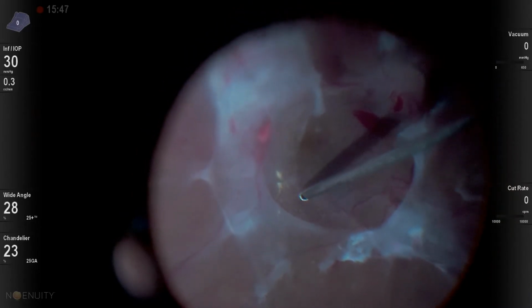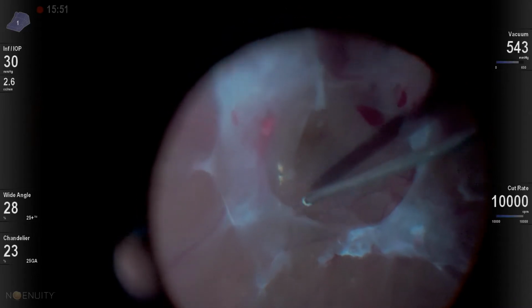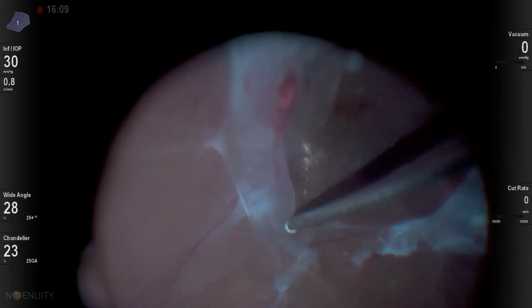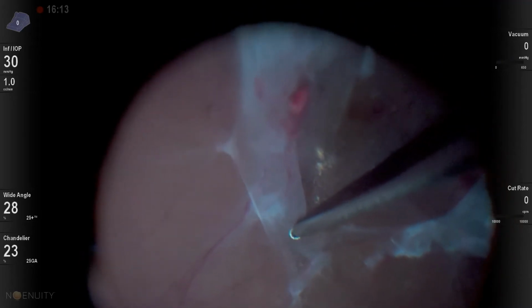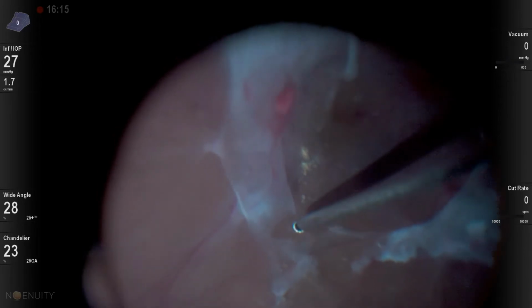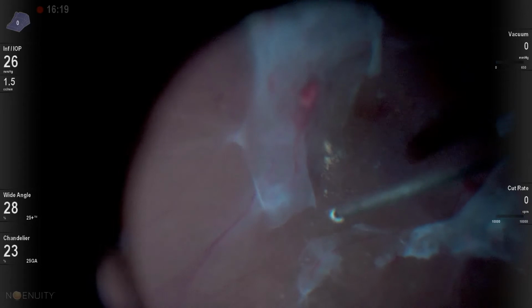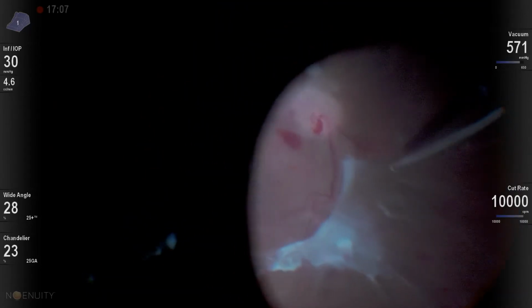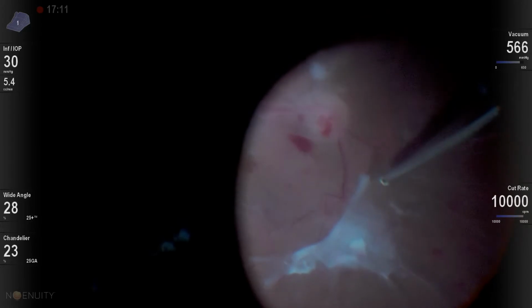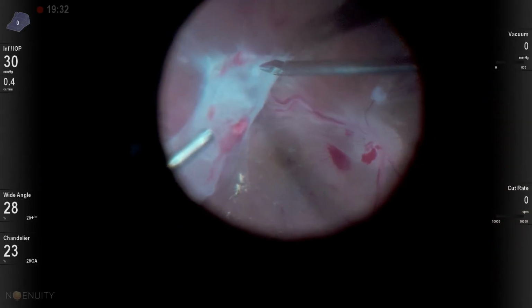And then I use this 25 gauge bevel cutter, 10,000 cuts per minute, to actually do a really nice segmentation across here. And I'm just looking for the easiest way to separate these fibrotic islands to create smaller islands that can then be more amenable to having the cutter remove them. Some of this fibrotic tissue is very entwined. Some of it's coming up very nicely with the cutter.